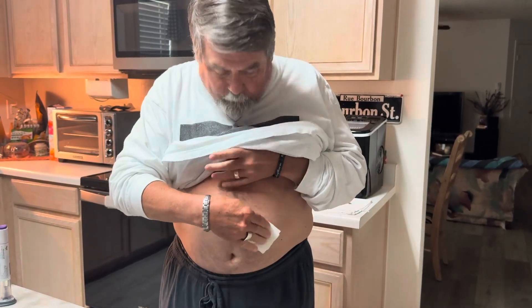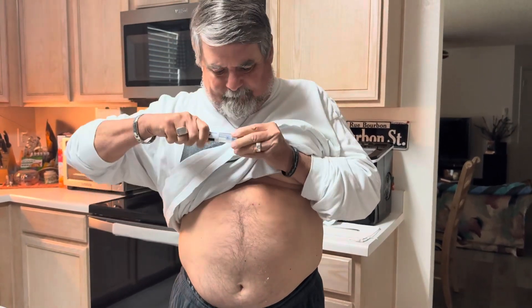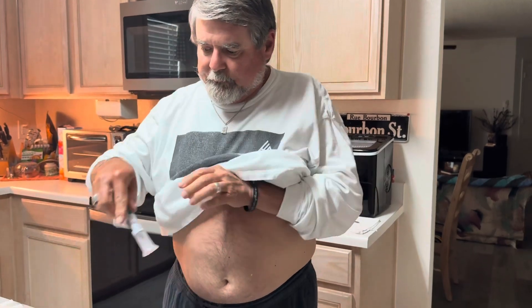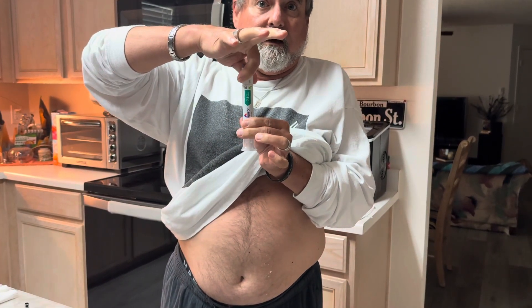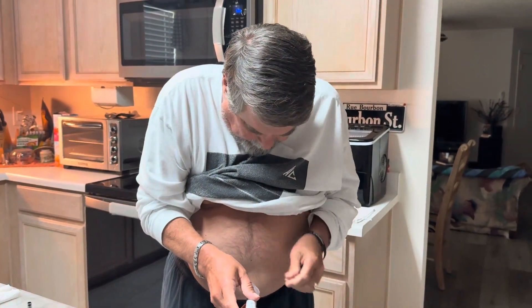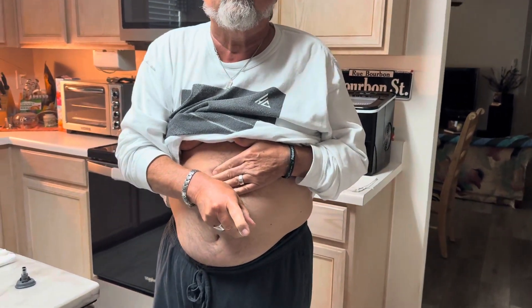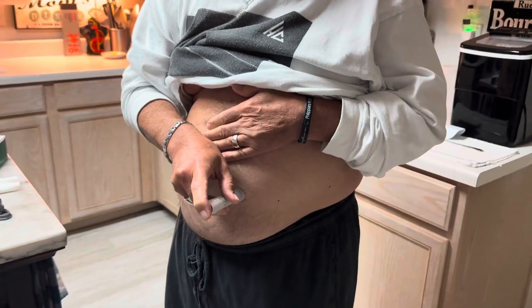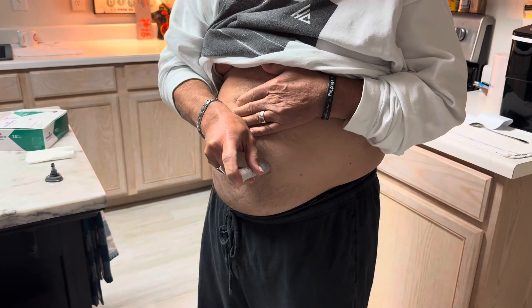I take my auto-injector here, pull off the end. It has an unlocked position and a lock — I unlock it. I aim, get the fuzz off, for one o'clock which is about right there. Press and hold — I'll hear one click and I hold it until I hear the second click.